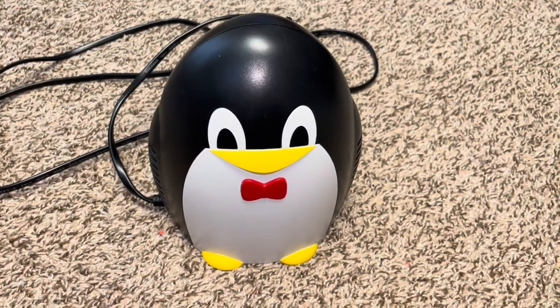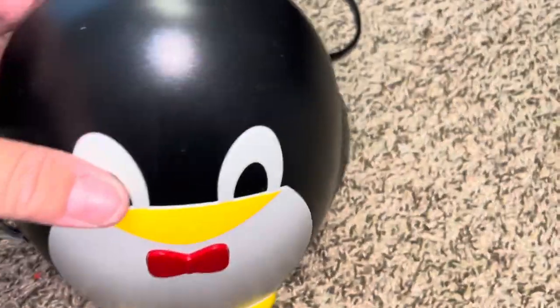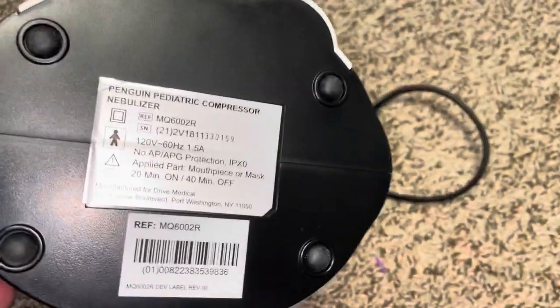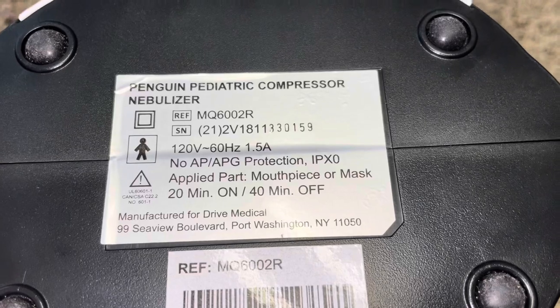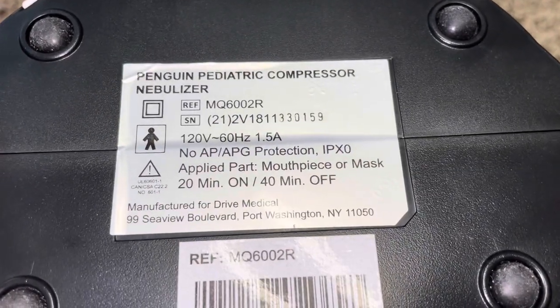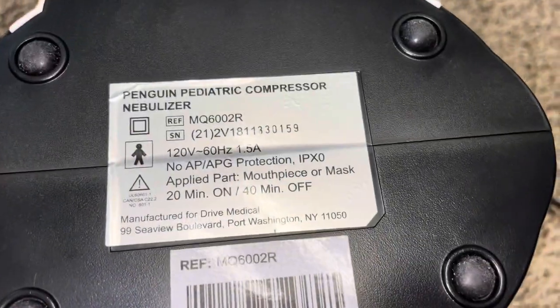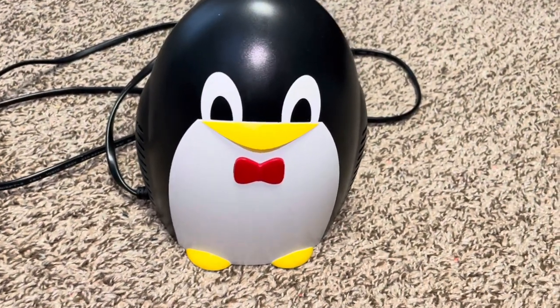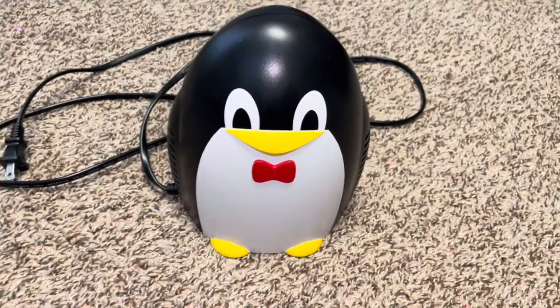Hey parents! This video is going to be on the penguin nebulizer. The official name is the Penguin Pediatric Compressor Nebulizer. This little thing is quite popular and I just had to start using it for my toddler.